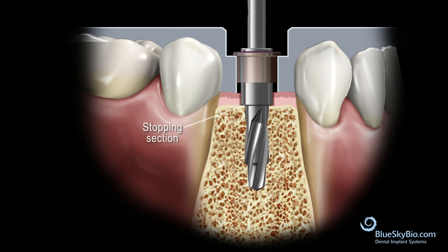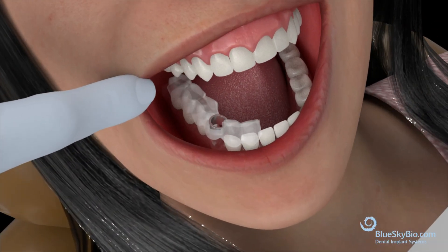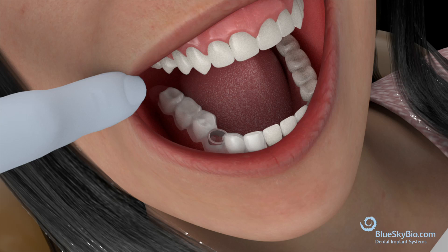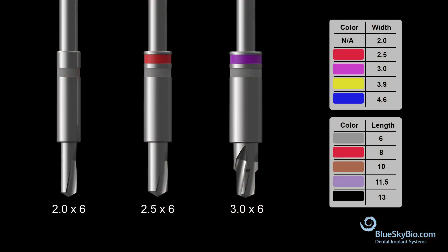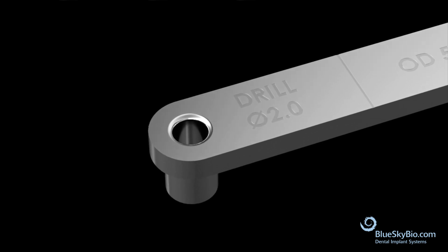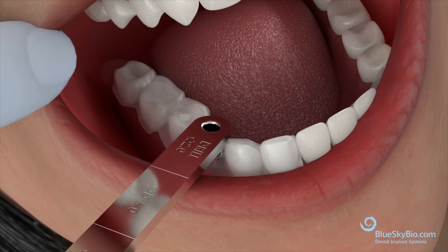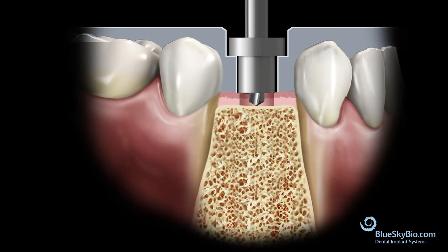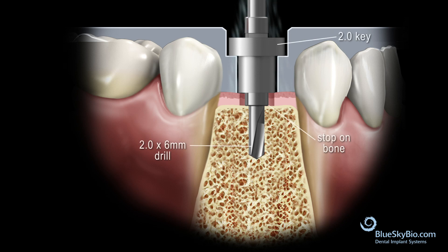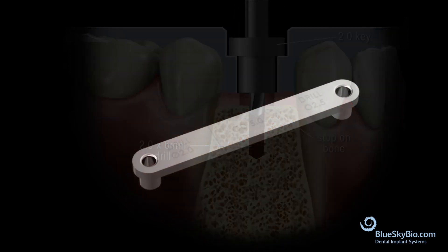The stopping portion of the drill will limit the penetration. We will be showing how to place a 3.5 diameter by 10 millimeter long implant. Verify fit of guide. Starting from left, the sequence is: 2.0 by 6, 2.5 by 6, 3.0 by 6. The 2.0 by 6 millimeter drill will use the 2.0 side of the OD 5 millimeter key. Place the 2.0 side of the key in the guide and proceed with the 2.0 by 6 millimeter drill.